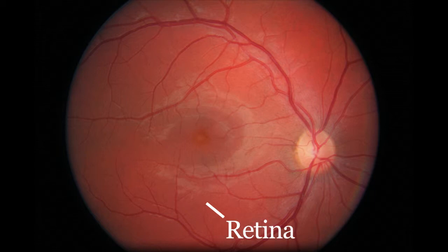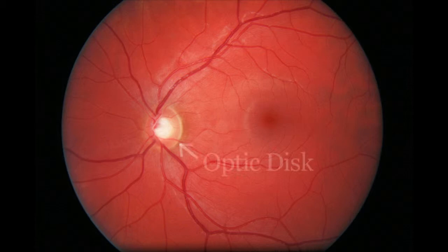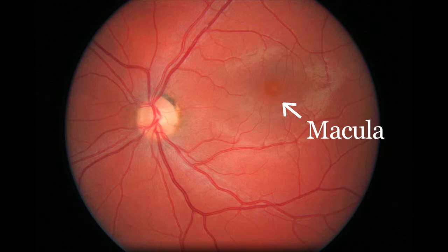The retinal camera is a specialized, low-powered microscope with attached camera designed to photograph the interior surface of the eye, including the retina, optic nerve, and macula. Regular photos document existing conditions so they can be monitored more closely. In most cases, your eyes will be dilated. Obtaining the images will take approximately 10 minutes.